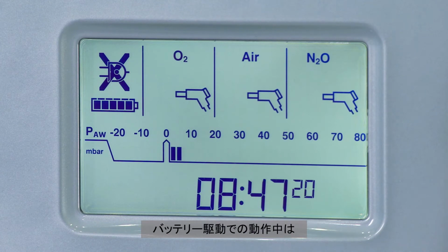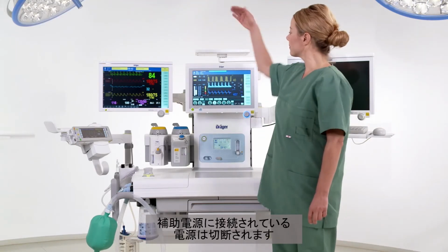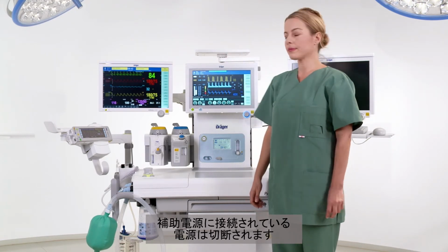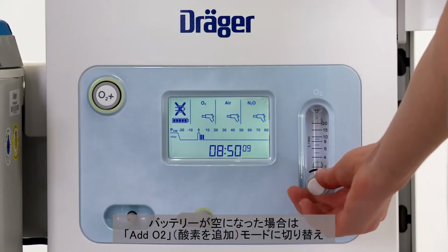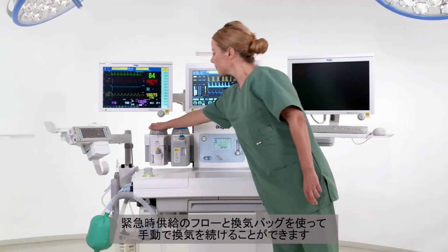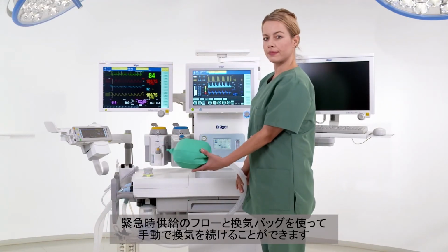During operation on battery power, the breathing system heating is deactivated and the power supply of the equipment plugged into the auxiliary power outlets is cut. Should the battery run empty, you can switch to the Add O2 mode and use the emergency delivery unit and the breathing bag to manually continue ventilation.